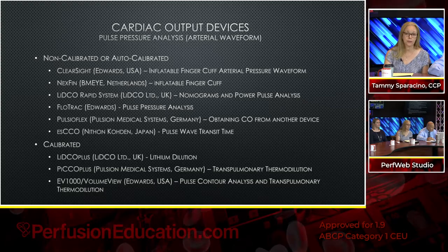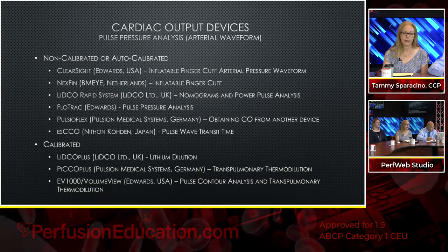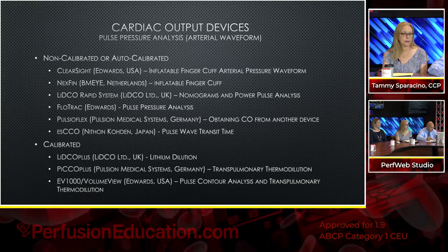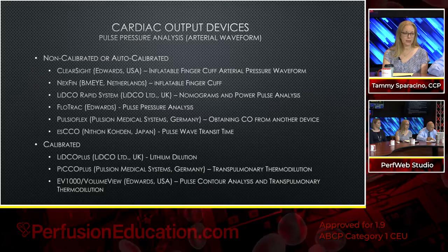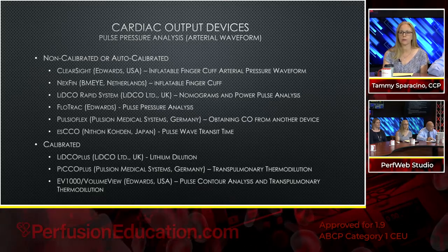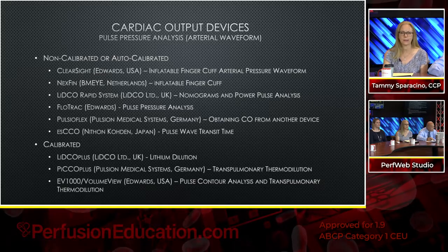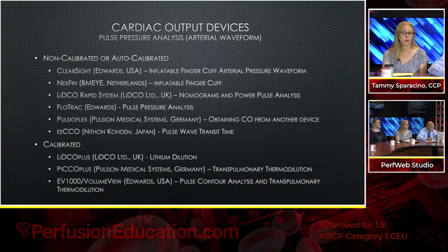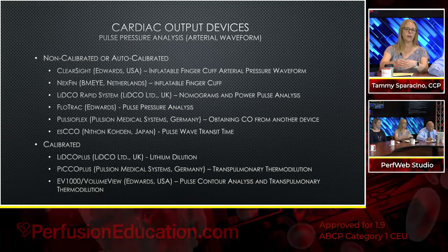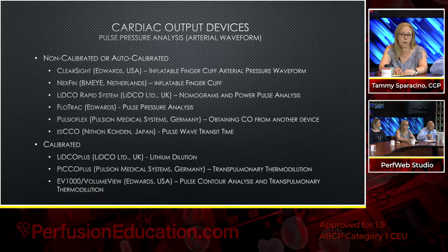PulsioFlex is very similar to FloTrac, but it can also be calibrated, because what they really like you to do is obtain your cardiac output from another device and then input that so you have a more accurate baseline. So I thought that was kind of interesting. And then you have, I'm not sure how to say this one, ESCCO, and it uses something called pulse wave transit time. So it's counting the time between the different waves in the pressure waveform.